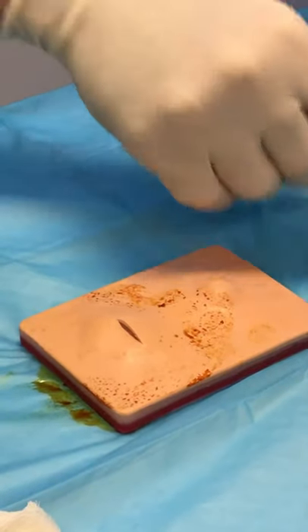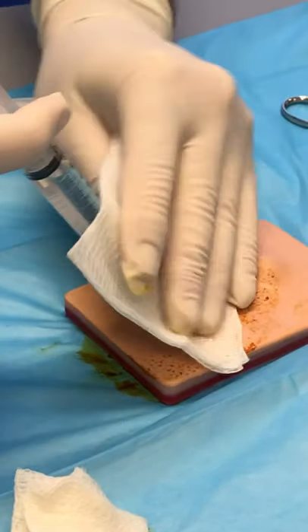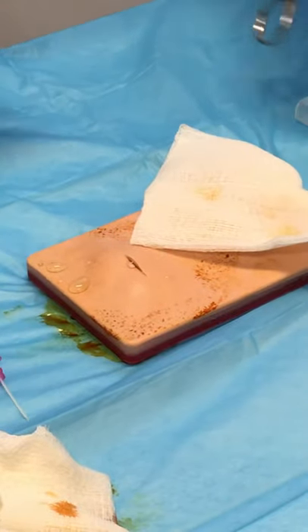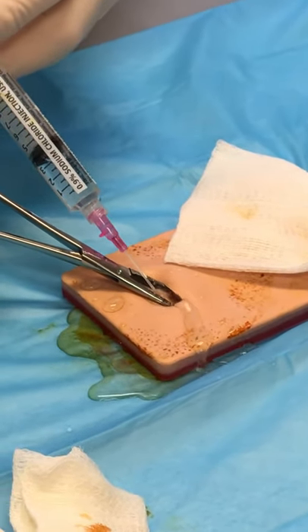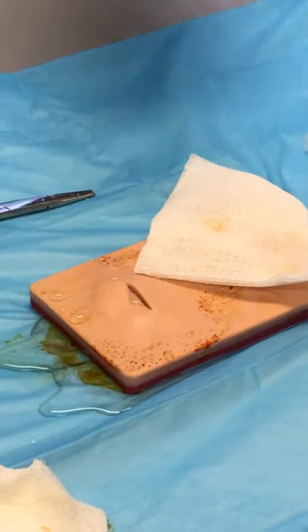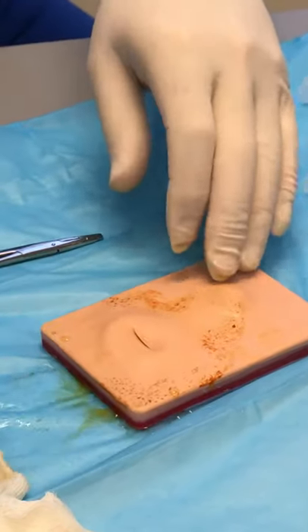Next, irrigate the bejesus out of this thing. A zero-tip would be best; failing that, get the biggest IV catheter you can find, cover it up so you don't spray yourself in the face, and flush it out really well. You'll want a basin with probably 50 to 100 cc's of solution — fill it up and flush it out repeatedly until the fluid running out looks just a little bit bloody and is running clear. That's basically the abscess treatment.